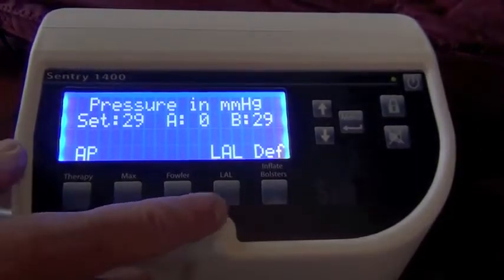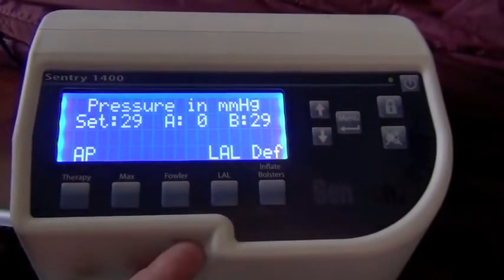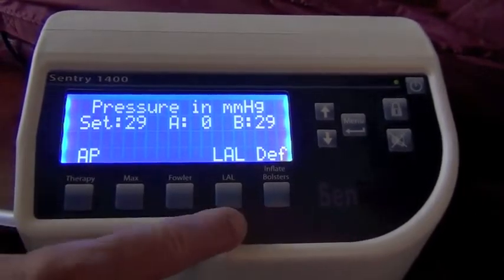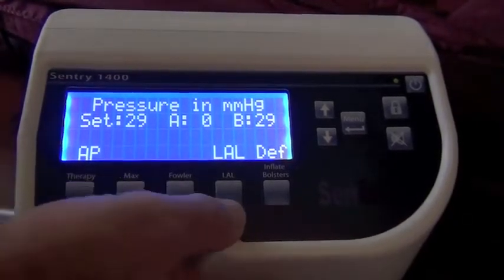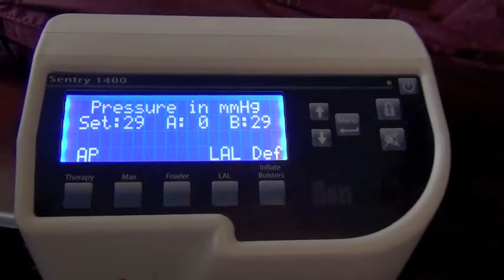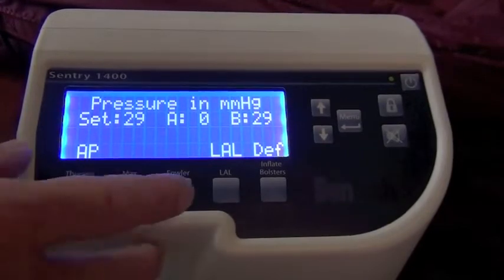However, in patients who admit to you dehydrated, it may be contraindicated. Someone comes in very dry and you're doing your best to maintain integrity of the soft tissues with lotion and other things. Probably the last thing you want to do is accelerate evaporative loss with the low air loss feature. And that's what its intent is under conditions normally where you have an excess of moisture.